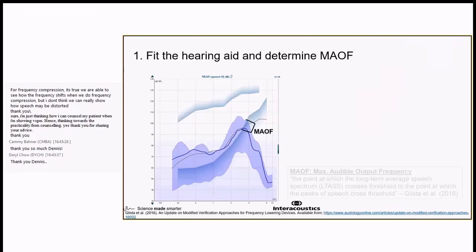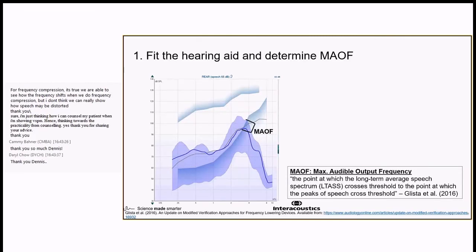I think when counselling for such a loss and such a feature, I'd first of all start off with the limitation of their hearing, in that in these higher frequency regions, their hearing is so poor that the signal on its own is inaudible. So they're missing areas of sound which allow them to identify speech.